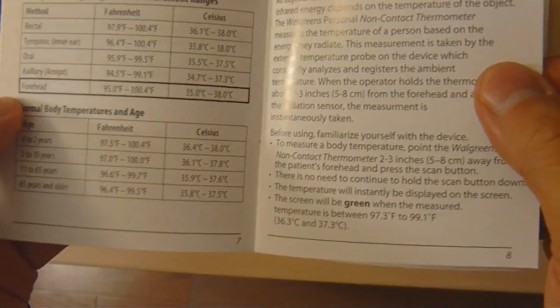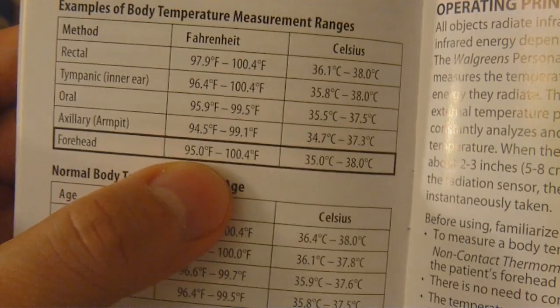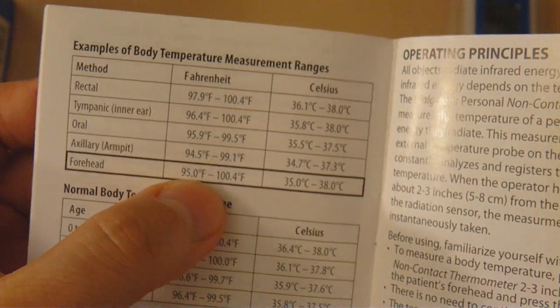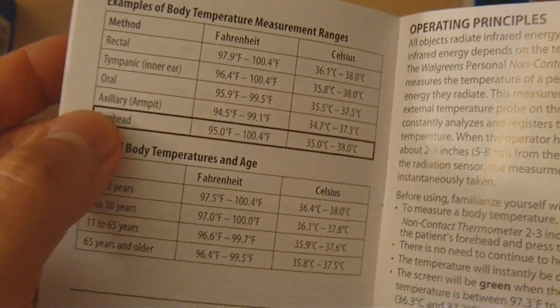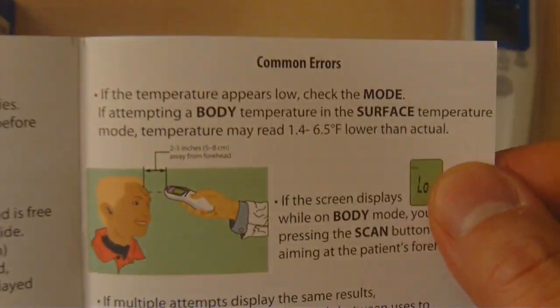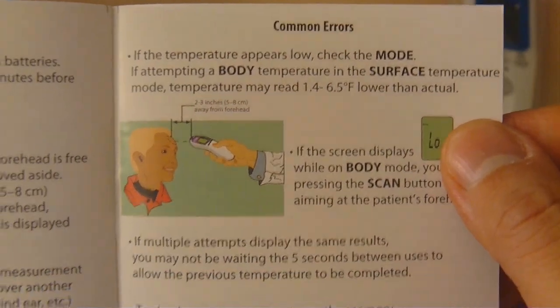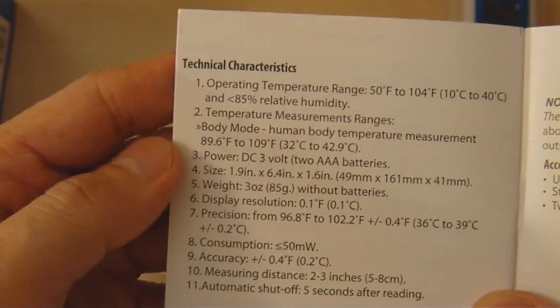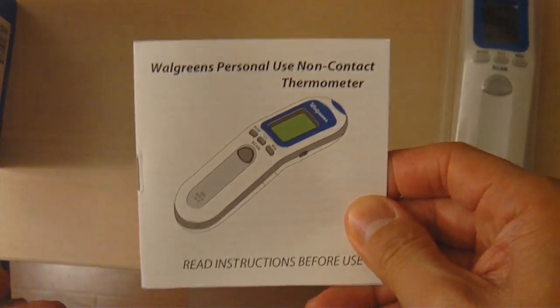It tells you that you're supposed to scan the forehead, and temperatures in Fahrenheit from 95 to 100.4 are typical for what is measured here. It tells you what the normal body temperatures are and it has this color coding. They also mention a page for common errors and how to resolve that. Always makes a good point to read the manual.